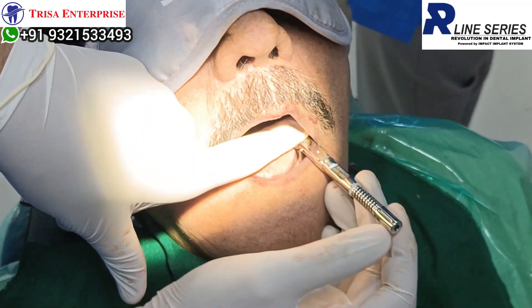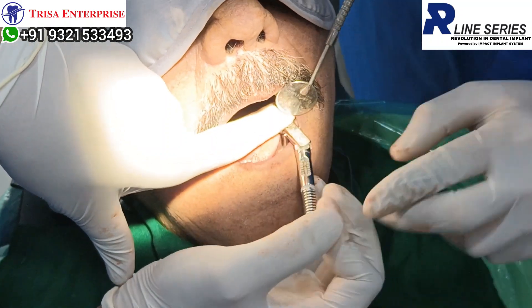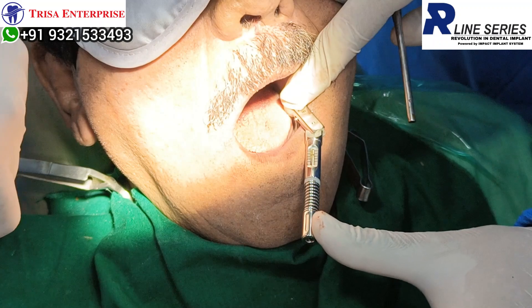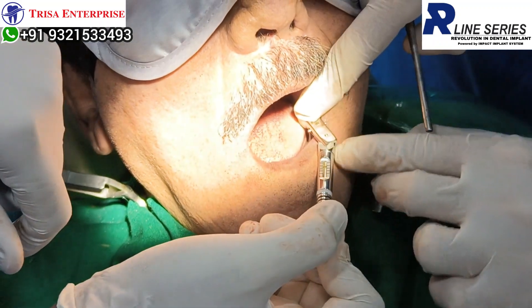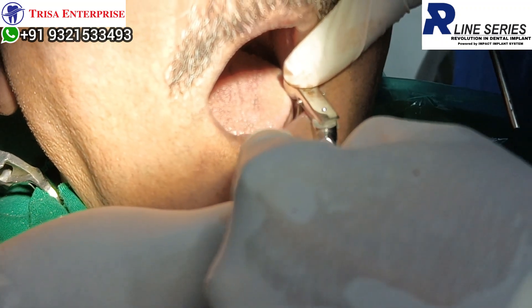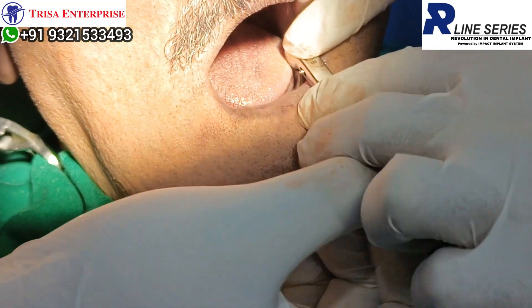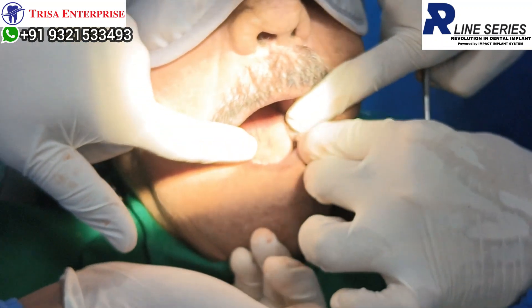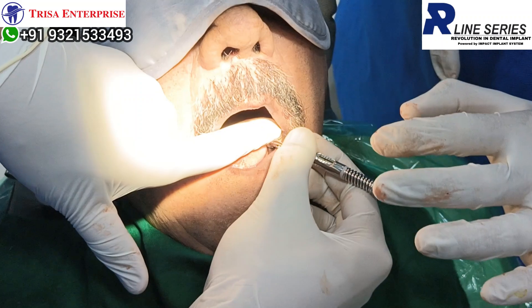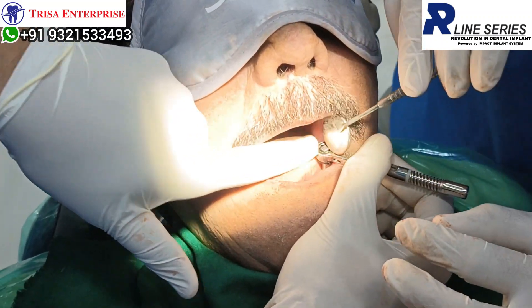What more we experience with the hand grip, here we are experiencing with the driver ratchet. Just do it — for beginners, just lock the drive. This driver ratchet is braking — can you see this? That means a torque of whatever setting has been kept, 45 or 50 Ncm, has been reached. You can hold it. Now it works as a right hand. Let me check the implant position.